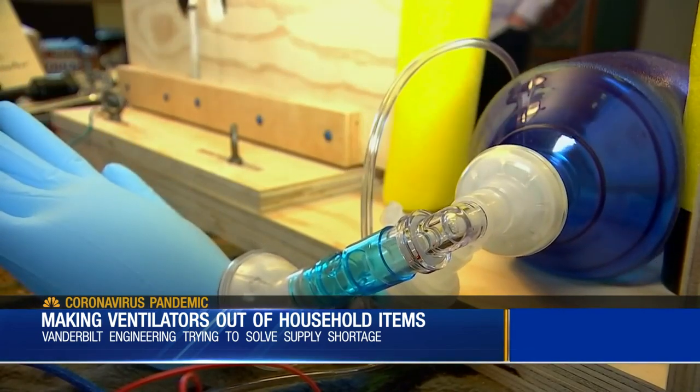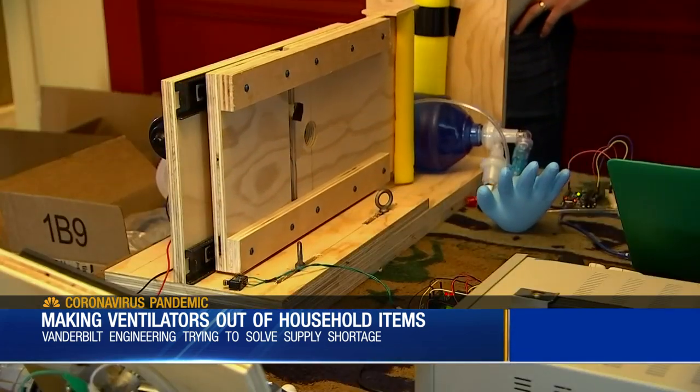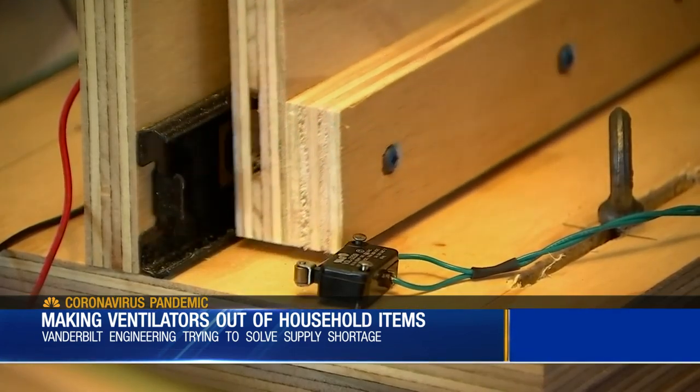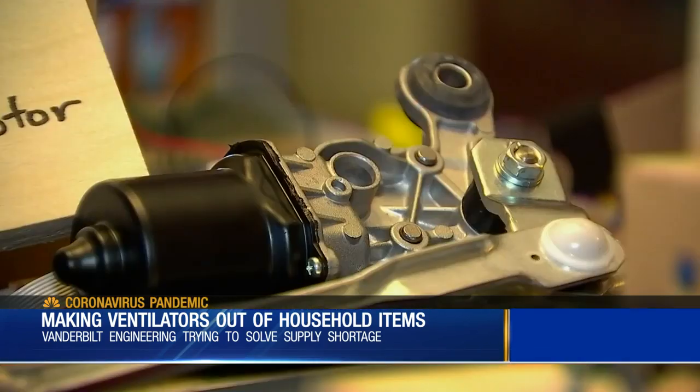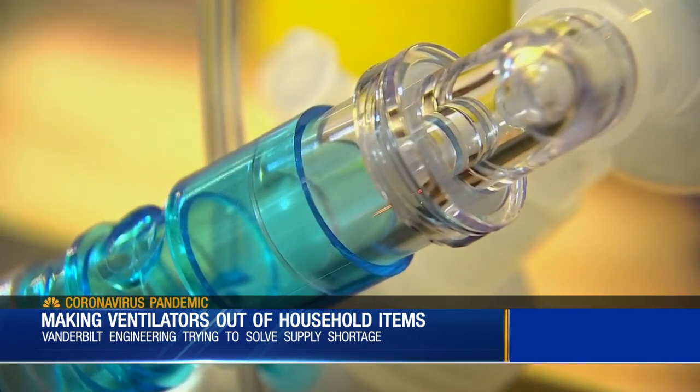We just started working on this less than a week ago and we've gone from nothing to a fully functional device in that short of a time. What just seems to be pieces of plywood screwed together, pool noodles, a windshield wiper motor, and some duct tape might end up saving a life.